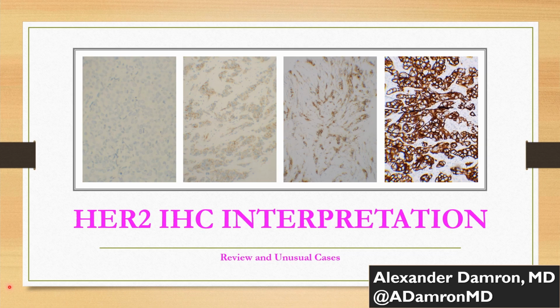Understanding HER2 and really what you're trying to display to the clinicians is very important, because you're making a very big decision, right? And that decision is, do I think this patient's going to respond to HER2 targeted therapy? And that's a lot of importance, right? Because HER2 anti-targeted therapy, trastuzumab, Herceptin, is really a great drug. These patients that have really strong HER2 positive disease respond very well, but your role is to tell them, is this patient going to respond? Does this patient have a chance of responding?